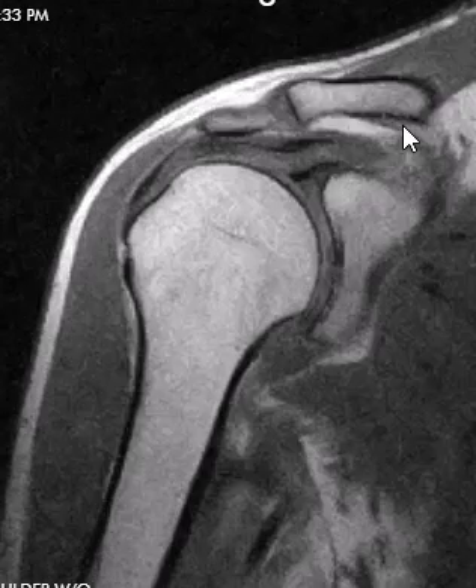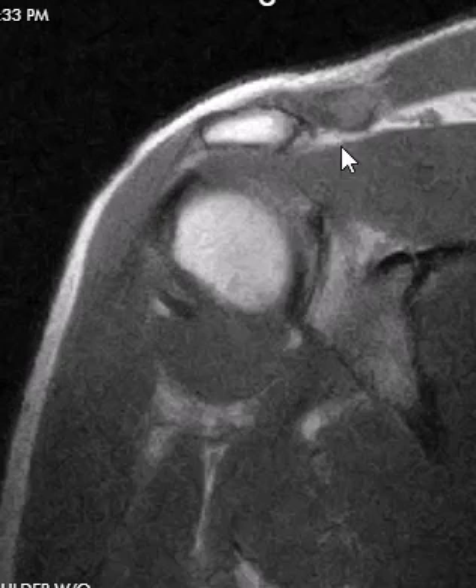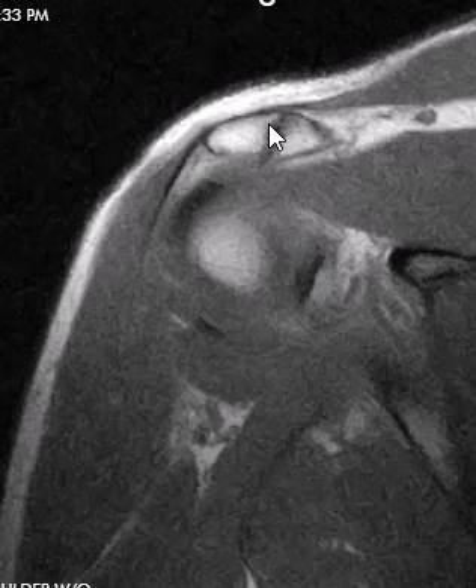But if we go posteriorly, we do see that there is — going posteriorly — what looks like another AC joint back here.